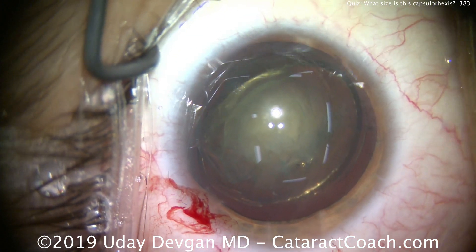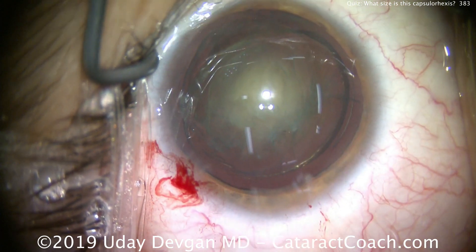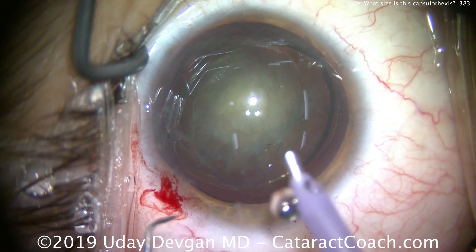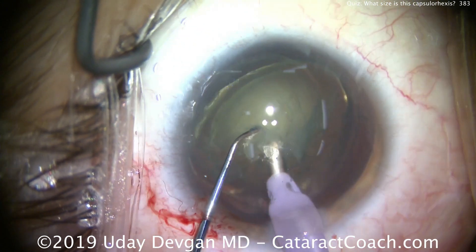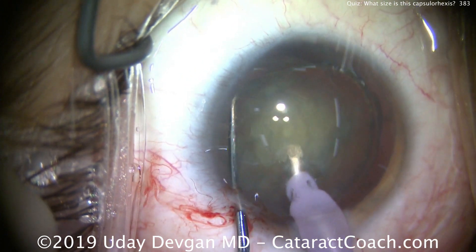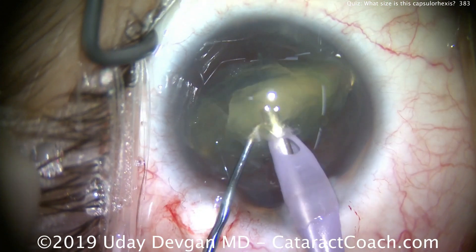In relation to the pupil size and the white-to-white diameter of the eye, even the lens size, that rhexis may look a little bit on the small side — it's smaller than we anticipated. There's the lens nucleus; we can buzz into the center of it and tilt it out of the capsular bag.